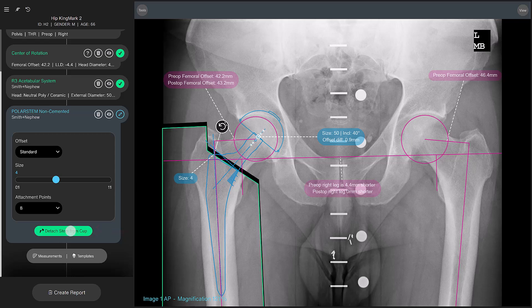TraumaCAD NEO performs the virtual osteotomy, moving the femur with the stem, thus allowing you to see how the surgery will modify the patient's anatomy.